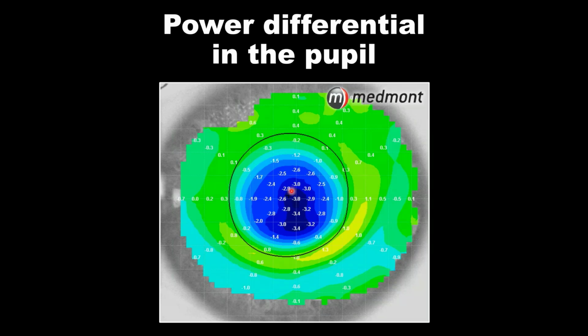The way you look at it is in the center, you notice we have a 3.8 diopter flattening in the center. But as we go to the periphery, it's about 0.1 diopter in the plus. So this patient has a 3.9 diopter RX change toward this meridian. If we head toward this meridian, we're at approximately 0.8 diopters of power. So there's a 3 diopter power shift from center to periphery. So of course, this analysis will depend in which direction you go. The goal, of course, being that pushing the maximum amount of plus in the pupil appears to be the way to do good myopia control.